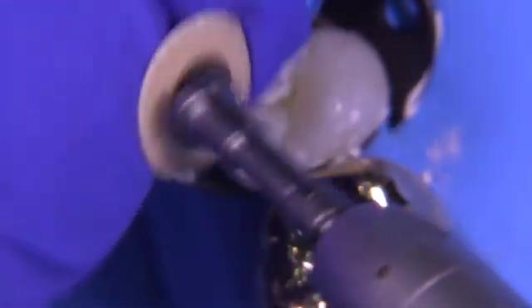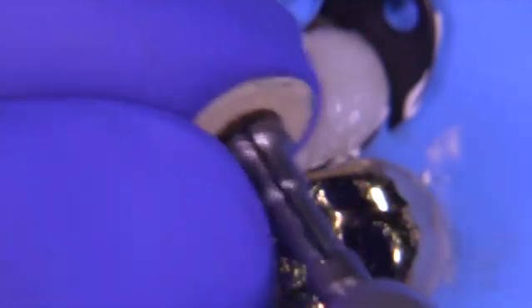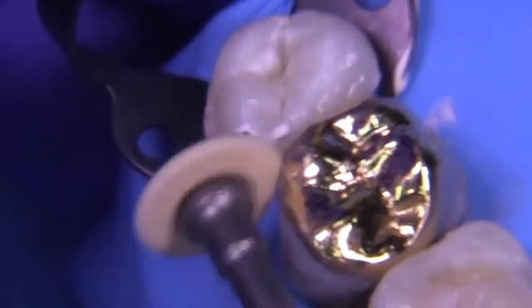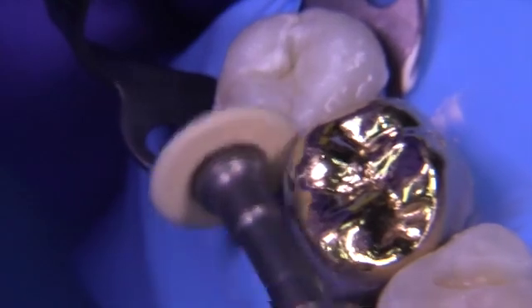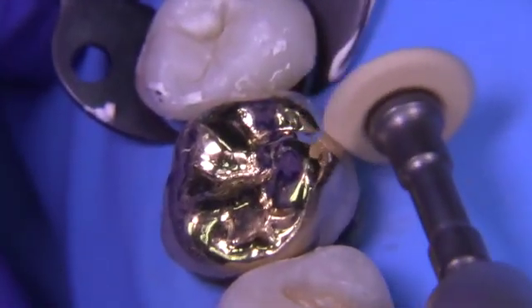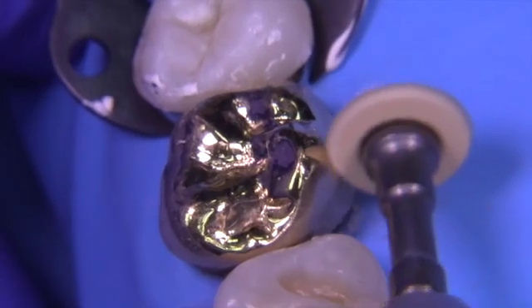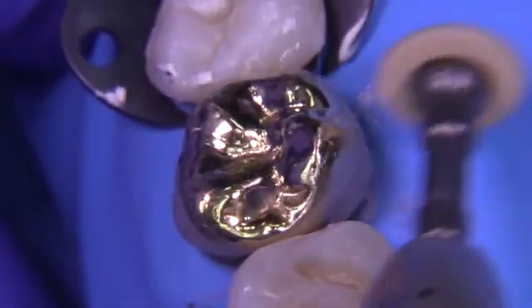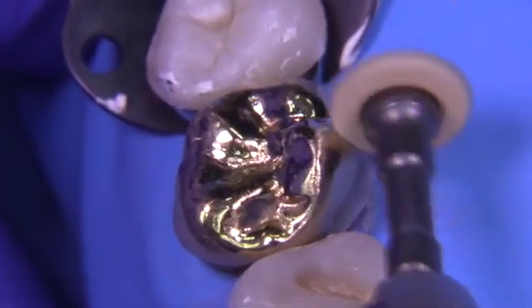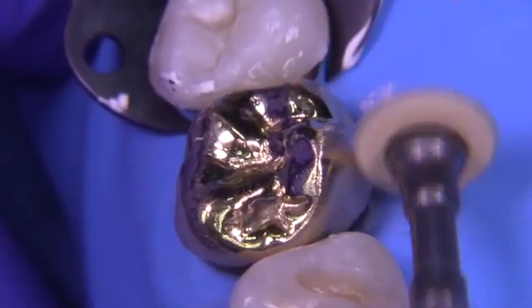Notice how we take the disc, flip it around, snap it back into the mandrel, and sometimes change the direction of the motor so we're always spinning from gold to tooth. In a macro sense the disc doesn't need to travel from gold to tooth — I'm moving it mesial-distally — but the spin is always going from gold to tooth. If we go the opposite way, it just doesn't seal the margins as well.